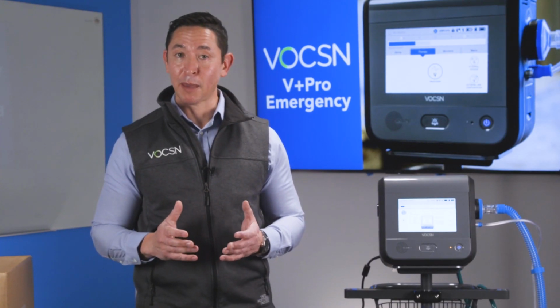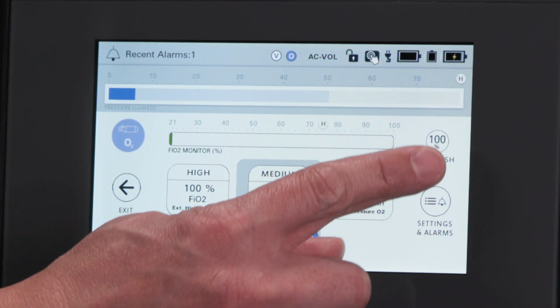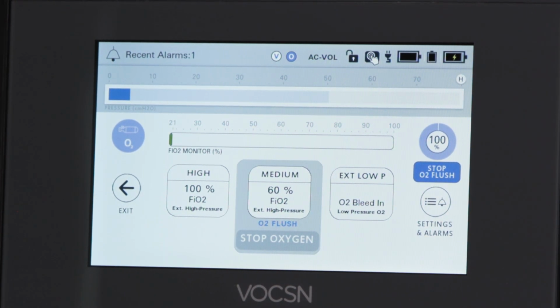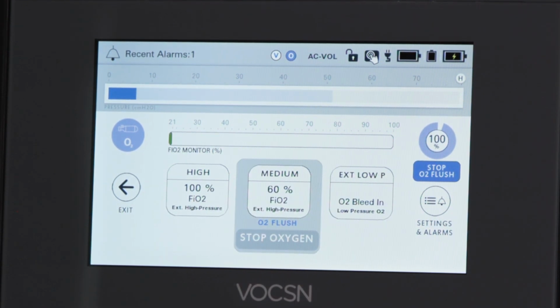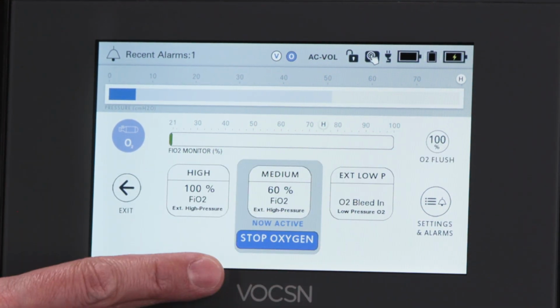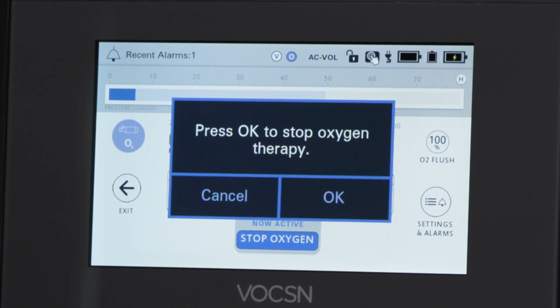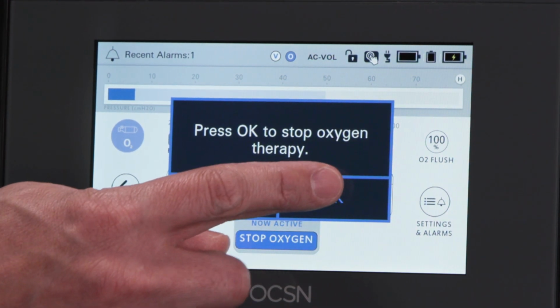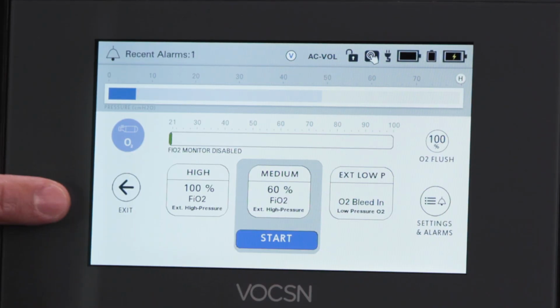So VOCSN also has the capability to deliver 100% oxygen via O2 flush. I can simply touch O2 flush. And now that's going to run for 3 minutes, and that's what that little timer is actually counting down for right there. If I want to stop the O2 flush early, I can by just touching stop O2 flush. And then you see we'll go right back to that 60%. So I'm going to hit stop right now. And you want to pay attention to these pop-ups because VOCSN's telling you what you want to do. In this case, I'm going to touch OK. And that's how we provide oxygen to our patients. So I can simply exit back out.